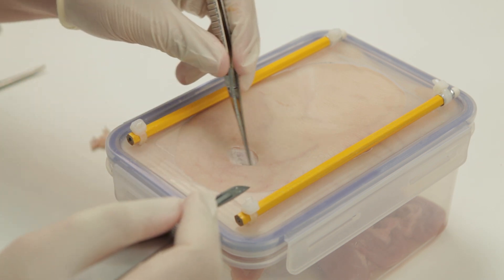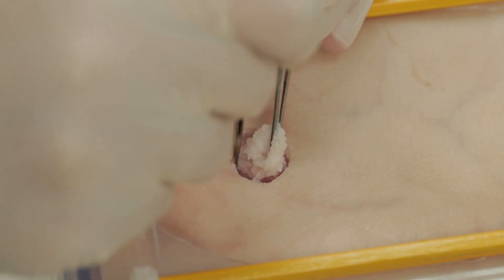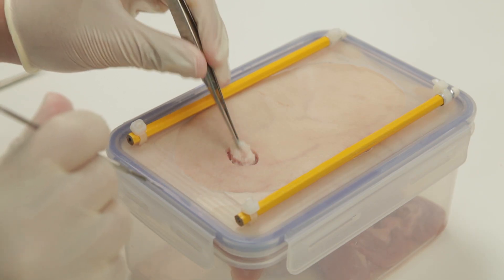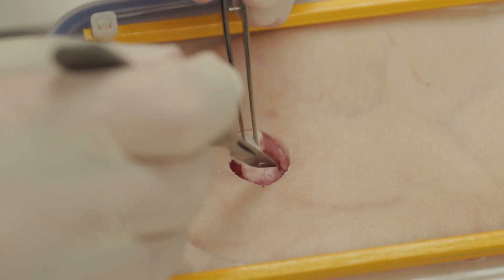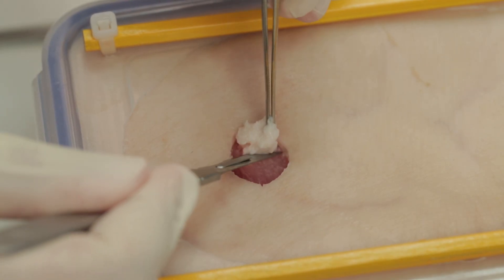Next, one must dissect a disc of adipose tissue or subcutaneous fat down to the muscular abdominal wall. One must take care to do this in an even manner so that the disc is the same diameter all the way down. Typically this is done with diathermy. Once down to muscular tissue, the disc can be removed.